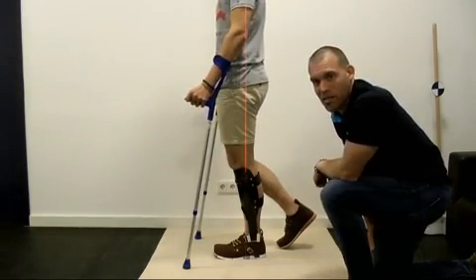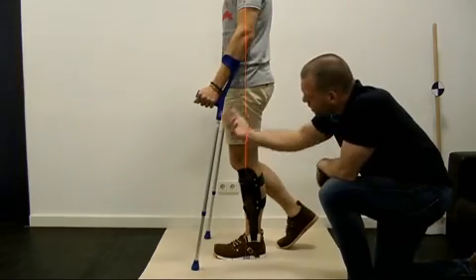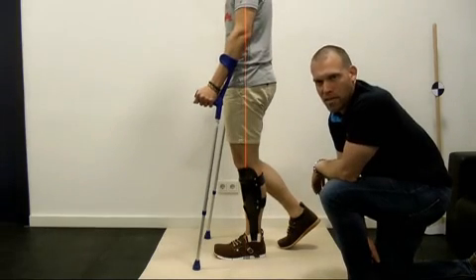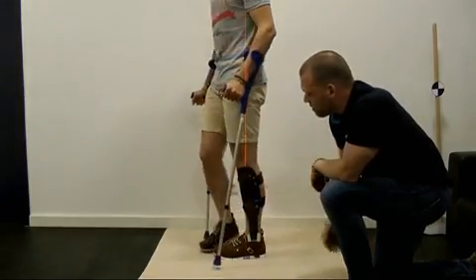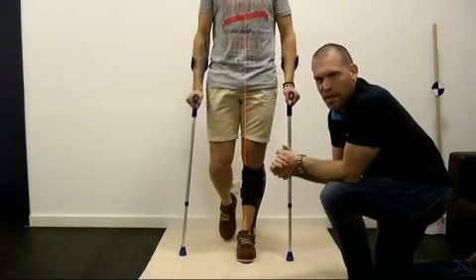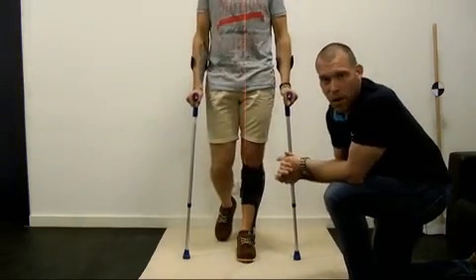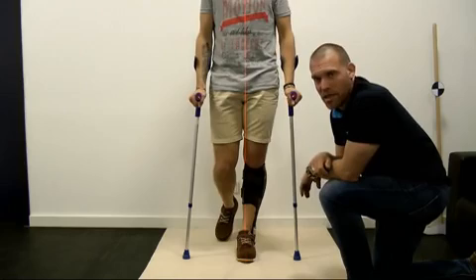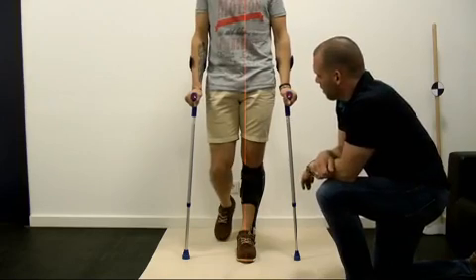Okay, this would mean that we are creating ideal conditions for the dynamics by idealizing the alignment, which will definitely help to reach the goal that we have in mind. All other alternative ways of standing for the patient are also, of course, possible, but certainly do not lead to the optimal biomechanical conditions for a dynamic gait, and do not fulfill the requirements for the patient to be able to walk. They do not support the patient's ability to walk in a physiological sense.